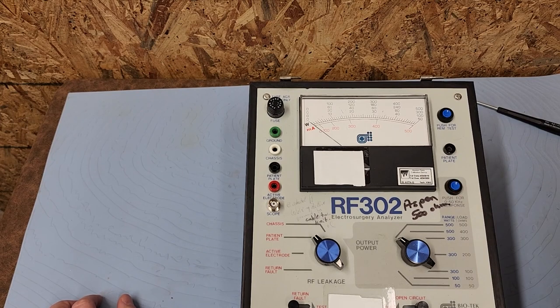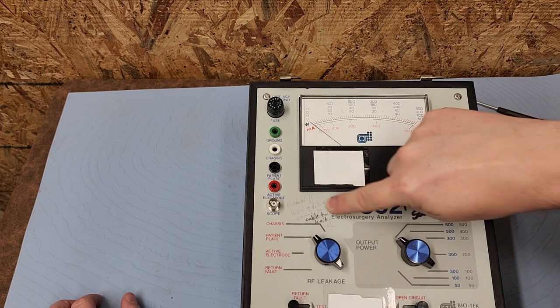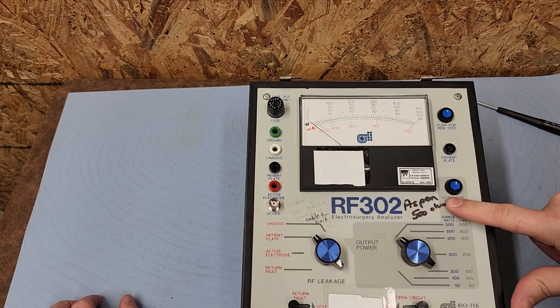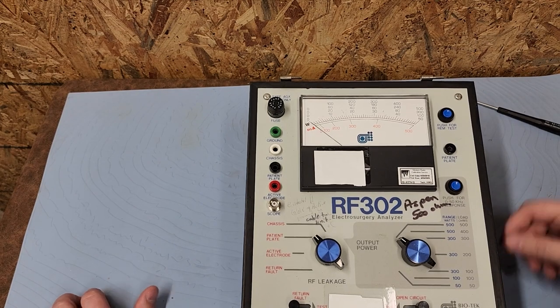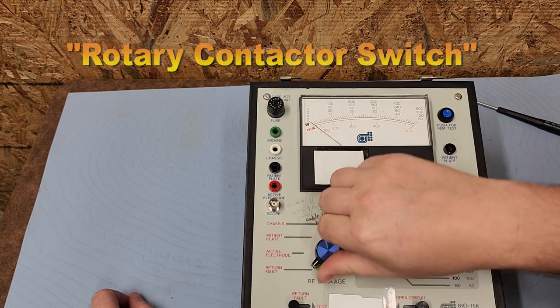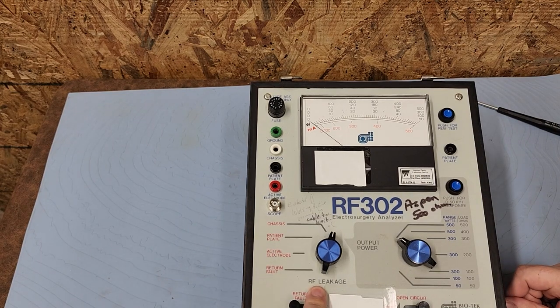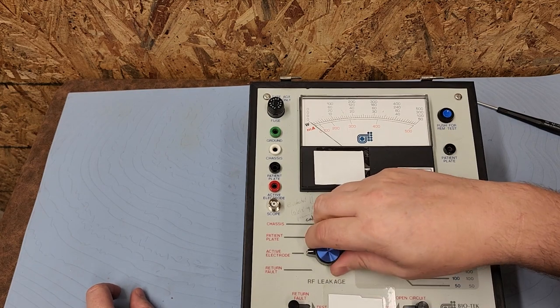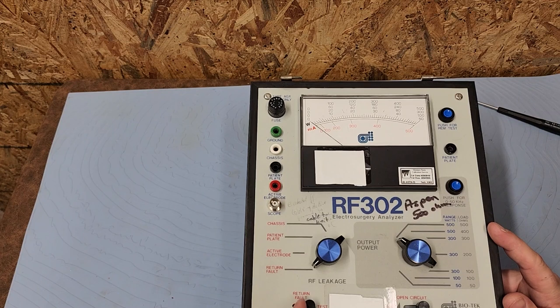This is my oscilloscope output. There's a button that says 'Push for zero to 50 kHz response' — can't say I've ever had to do that. Somebody wrote 'Aspen 500 ohm' on here, and somebody else wrote something in different penmanship. This thing has years of people writing notes right on the face. Over here are the rotary dials with firm clickety-clacks — return fault, active electrode, patient plate, and chassis — all under RF leakage. So we're measuring leakage on this side.